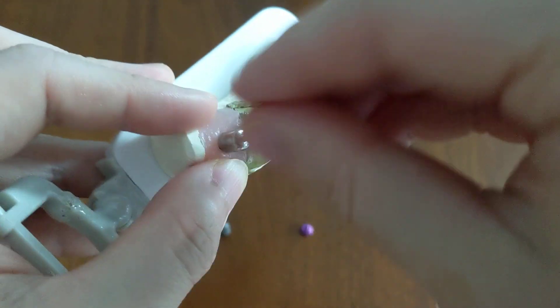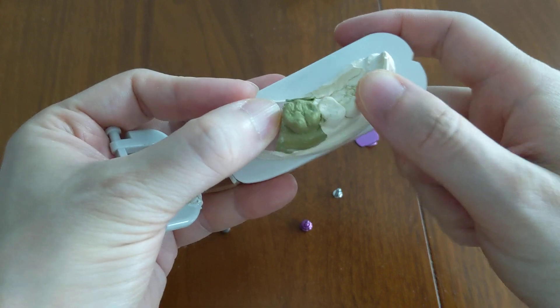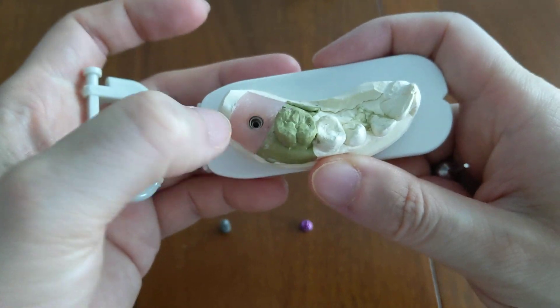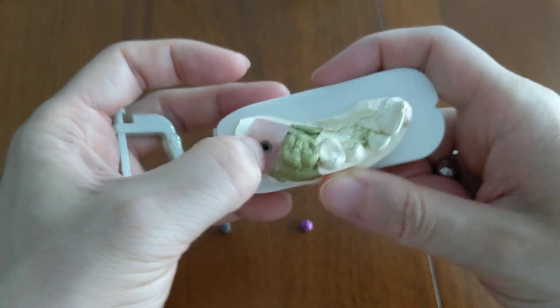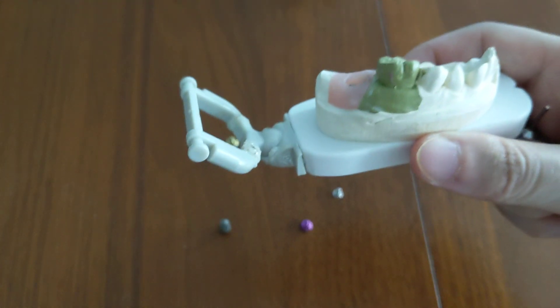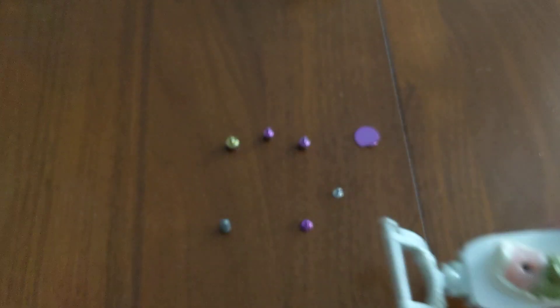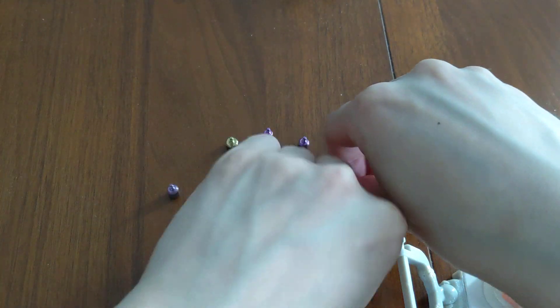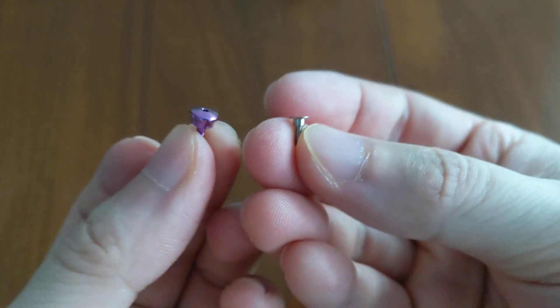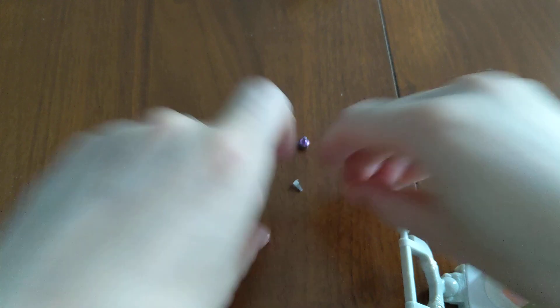Once the healing abutment is on, the gums heal around it. When you're ready for the crown, the hole is kept open — the gums are literally pushed away — so your dentist can place the crown on top. If the gums closed over, you couldn't put a tooth there. The purpose of the healing abutment is to shape the gums and keep the hole open, kind of like leaving an earring in your piercing hole. So to summarize: the cover screw is like a manhole cover, and the healing abutment is like an earring.